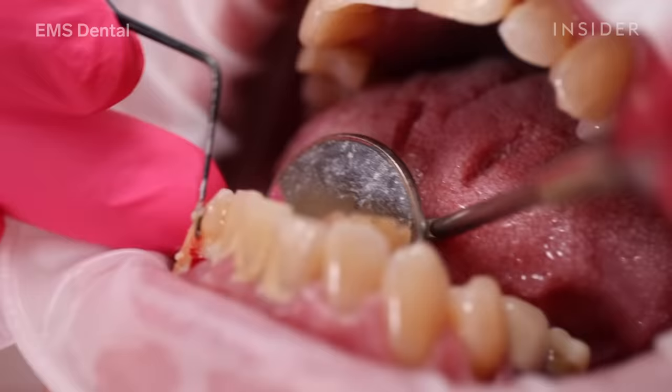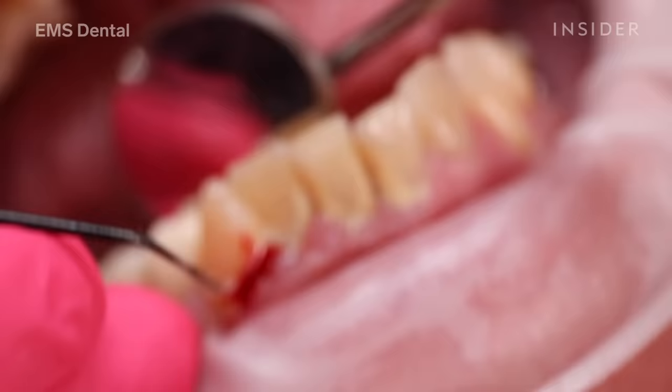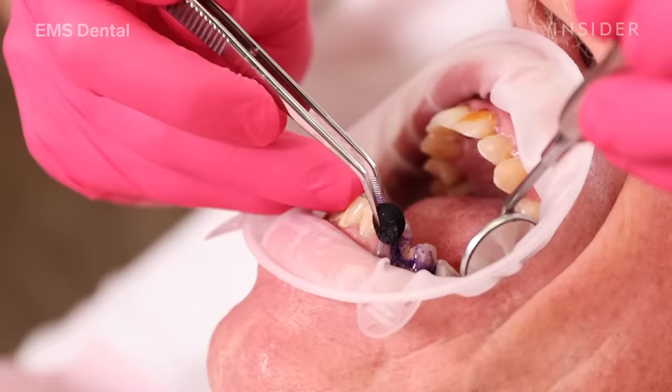Here we can see plaque and calculus deposits, but more concerning is the colour of the gums, which are red and also puffy and swollen. That would lead us to believe that either gingivitis or even periodontal disease could be present here.